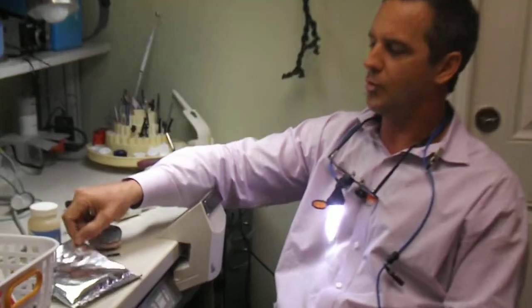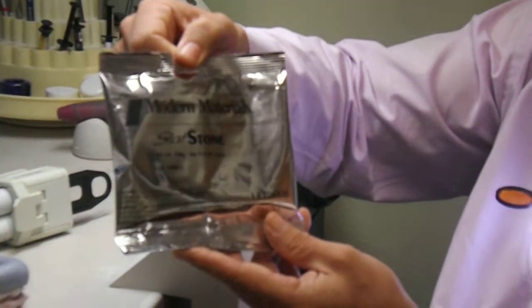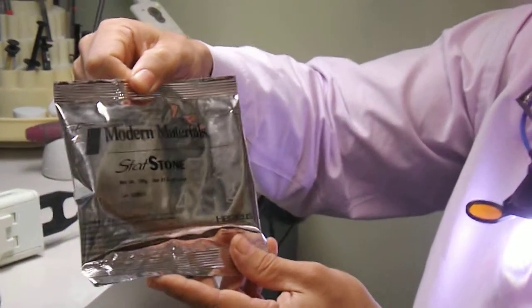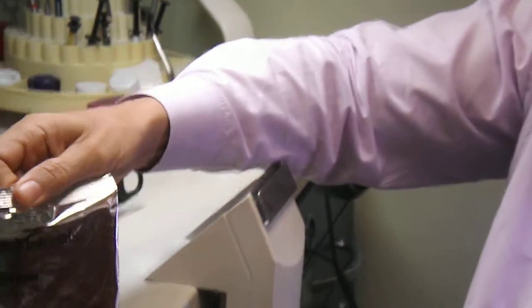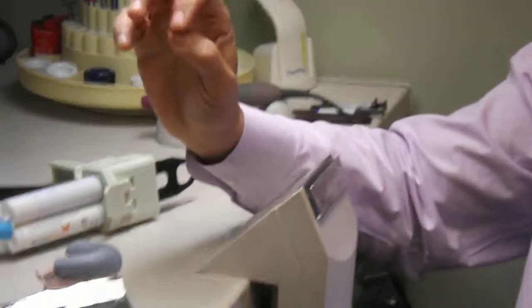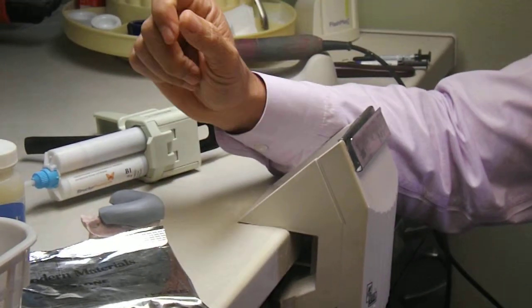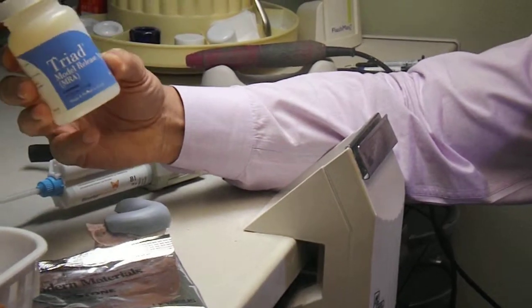What I've done is I've poured a model with StatStone by Hiraeus. This sets in two minutes, so we're not waiting a long time for the model. Once I've got that model, I groom it, take off any gloves. If there's any voids in it, I'll place a flowable composite and cure it real fast. Then I coat the model with Triad's model release agent.